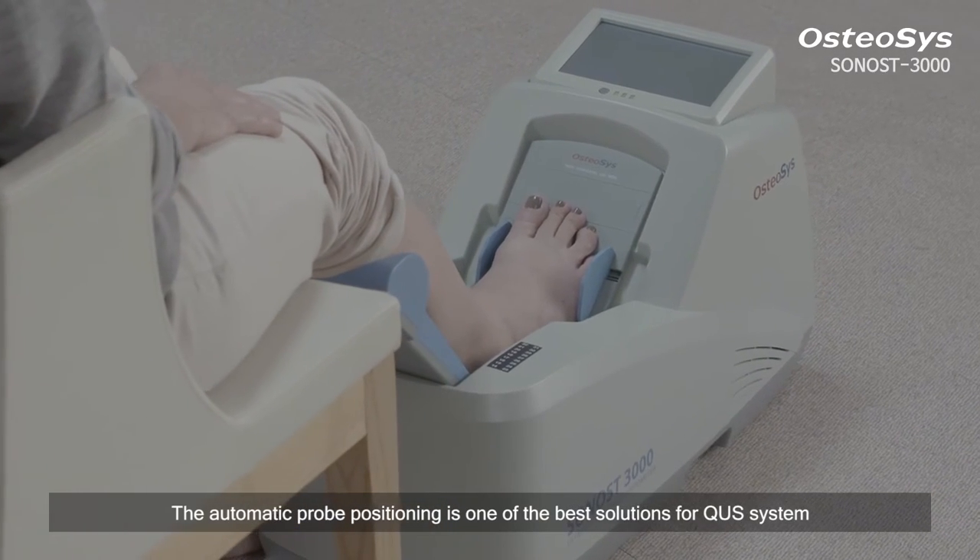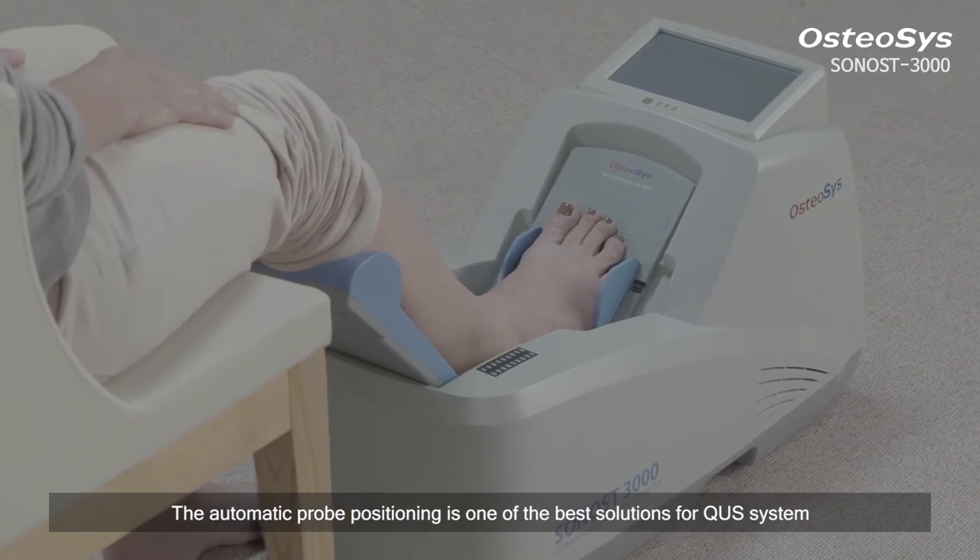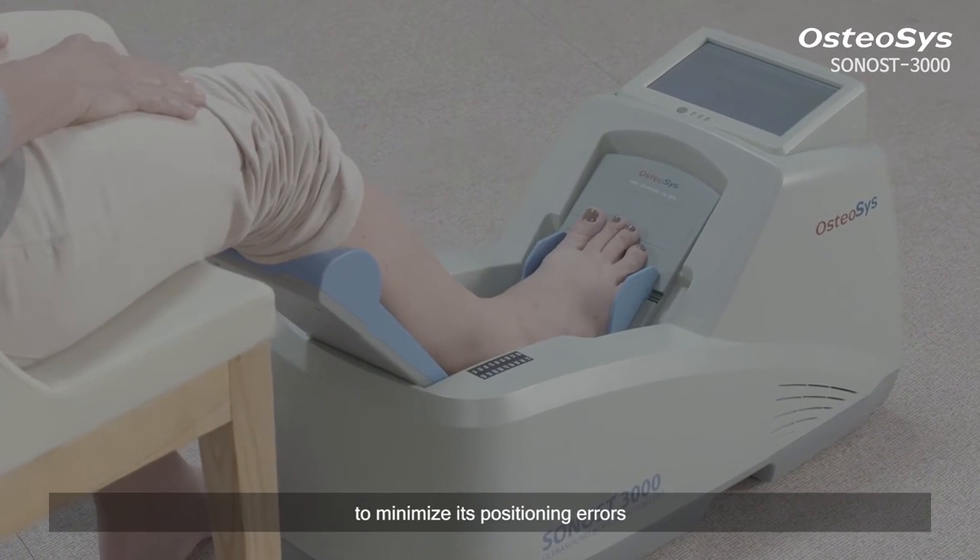The automatic probe positioning is one of the best solutions for QUS system to minimize its positioning errors.